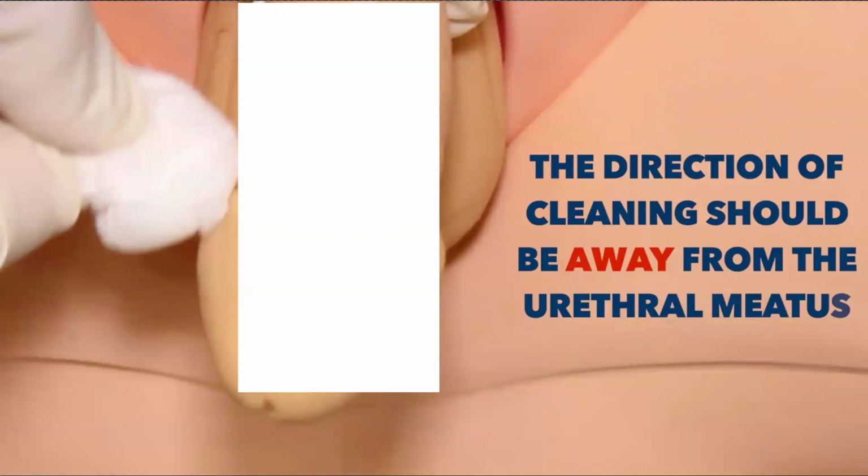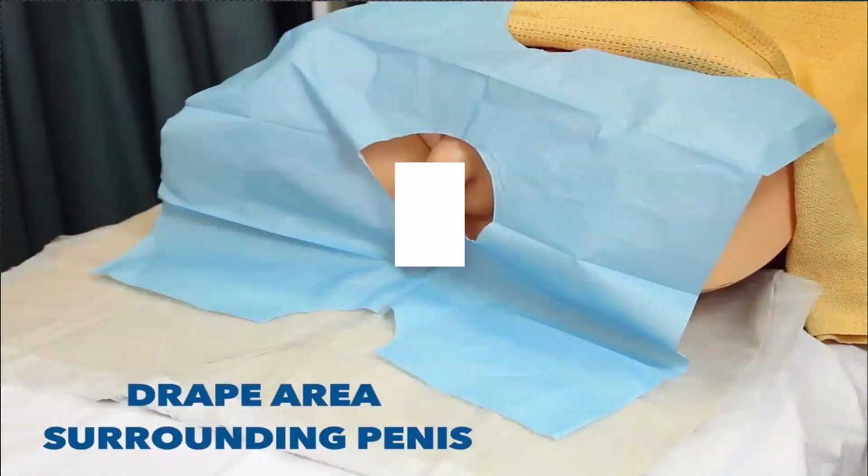Okay, so after you've done that, you want to clean the penis away from the urethral meatus. As you clean, you dispose of the cotton wool balls. The next thing would be to remove the gloves that you've put on and wash your hands again. This time around, you now need your sterile gloves. And after you've done that, you would drape the patient, and then you put a kidney dish under the penis.